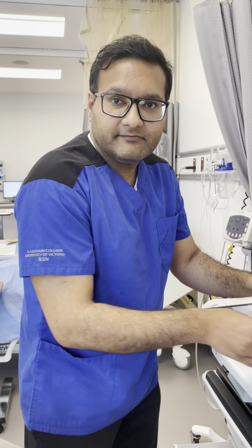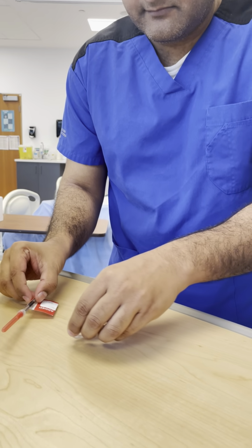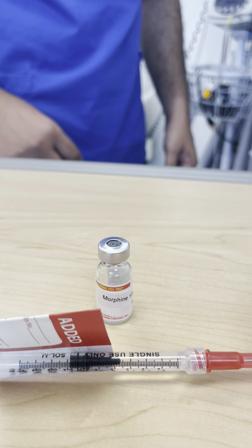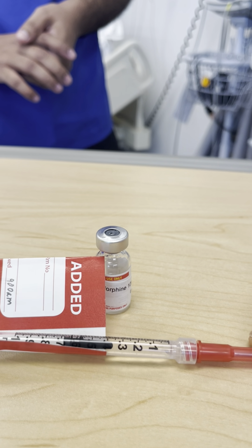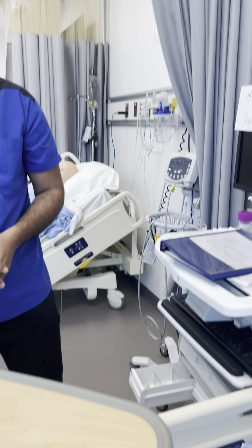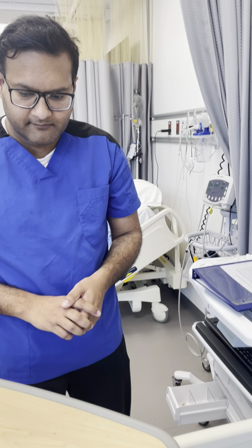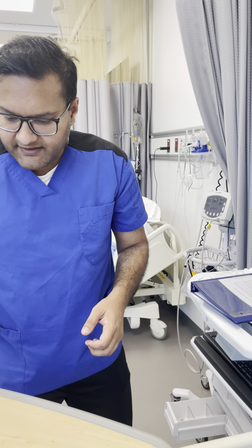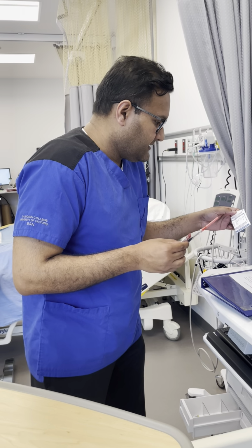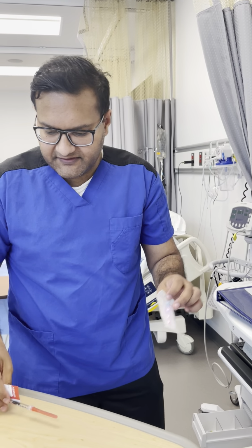And I'll zoom in. And then I'm going to be attaching the medication now. Alright, making sure that the space is tightening. And pushing it in and twisting. And then I'm going to be pushing it in slowly. Alright, Cal, I'm just going to be tapping on your skin here. Don't worry, it's nothing. With that said, I am now going to prepare the right needle, in this case here.